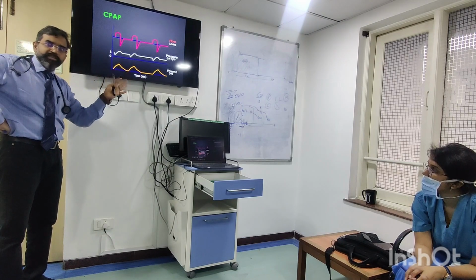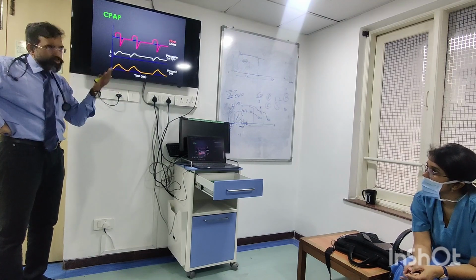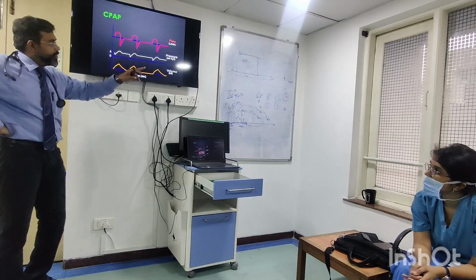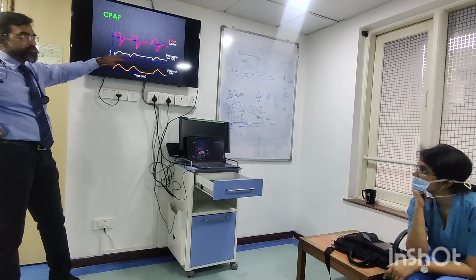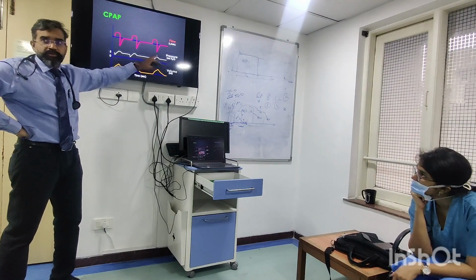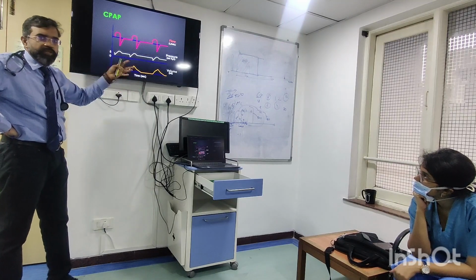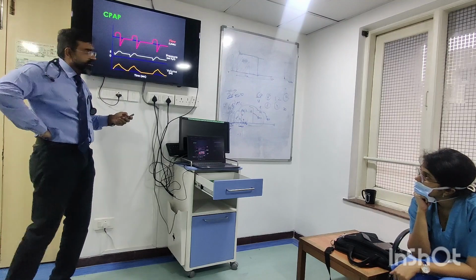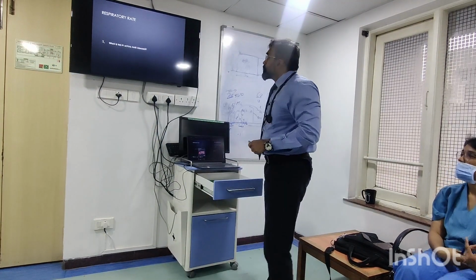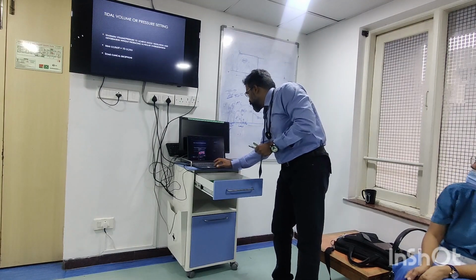Here the patient is breathing. Limit: again no limit. Cycling: no cycle. All that the ventilator is doing is giving a pressure, a baseline pressure. In that baseline pressure, the patient is breathing up and down, breathing up and down. This is CPAP. You see the volumes, they are what you see normally otherwise, nothing different. Clear? CPAP clear on this? Alright. So now that you've understood this much.